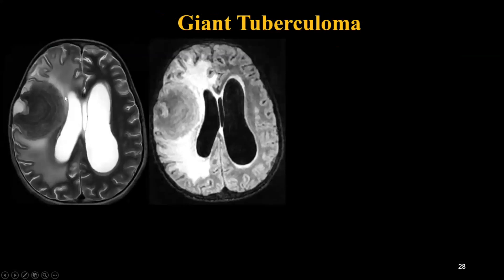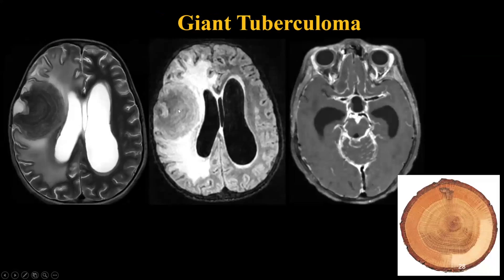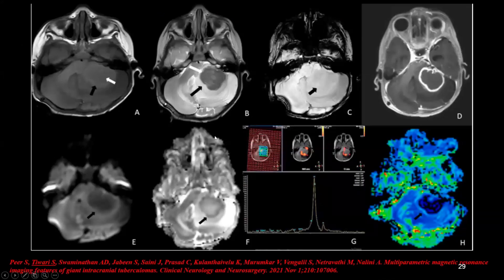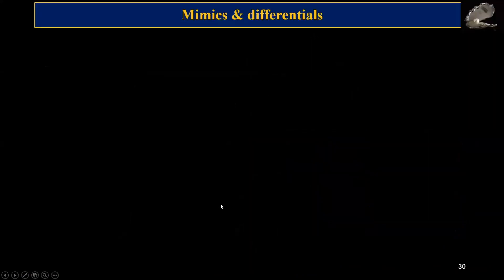Sometimes you can find giant tuberculomas which can be confused with tumors. Like in this case, there is a very well-defined lesion with a tree-bark or onion-peel-like appearance in the right frontal lobe with extensive perilesional edema causing mass effect. On contrast study, they show peripheral enhancement with this tree-bark-like appearance and associated meningitis. On perfusion study, they will not show raised perfusion because it is an infection; there will be a large lipid peak on spectroscopy and diffusion restriction will be absent or present only at the margins.